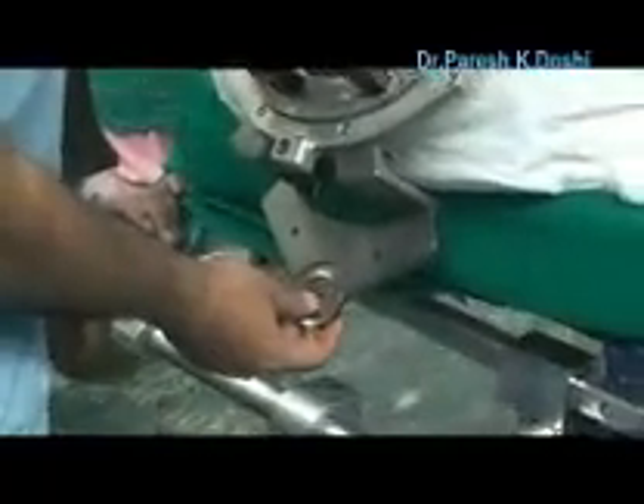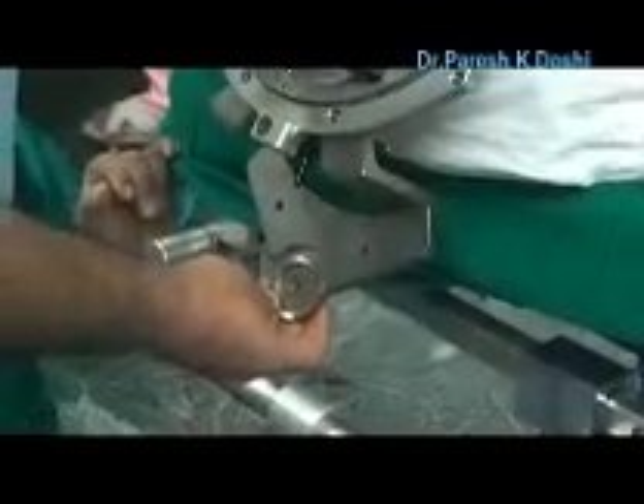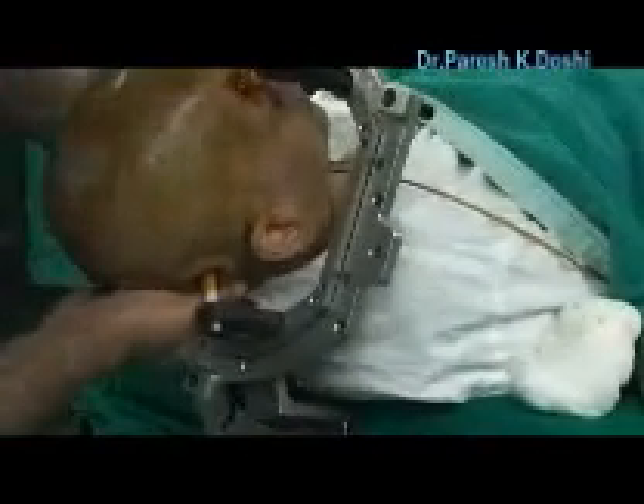This is like a Mayfield head clamp. You can rotate it any direction. Some patients have dystonia, so they want the neck to be a little twisted, and you've got to adjust it the way they want it. This is more or less pretty straight now. Just lock the brake off.